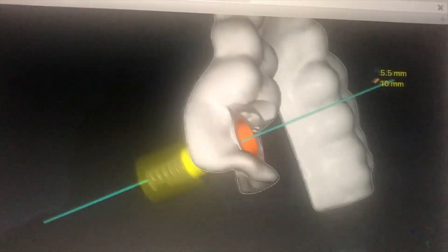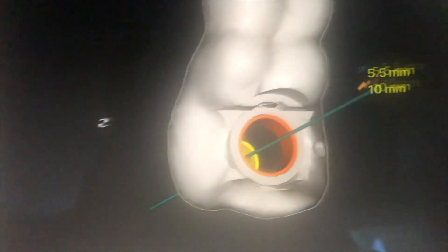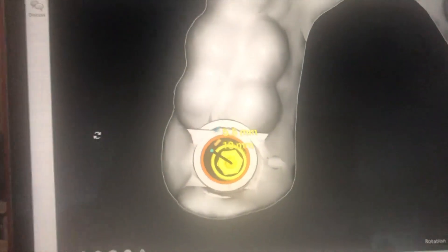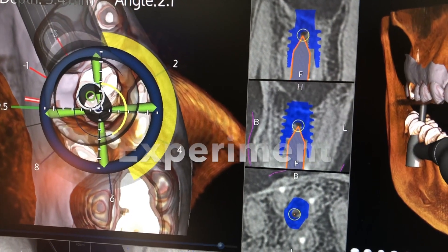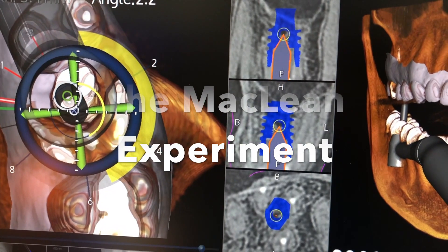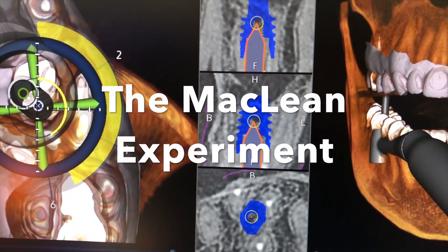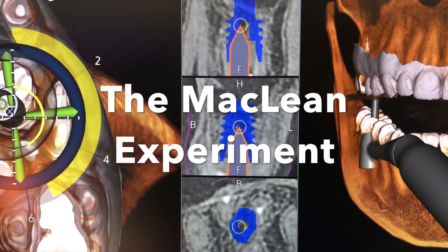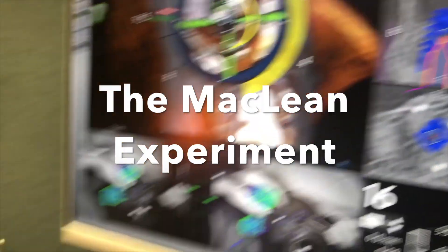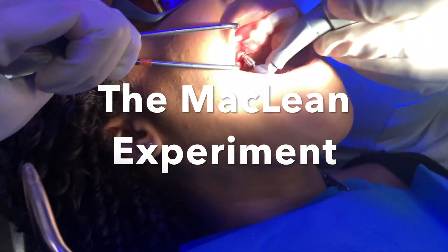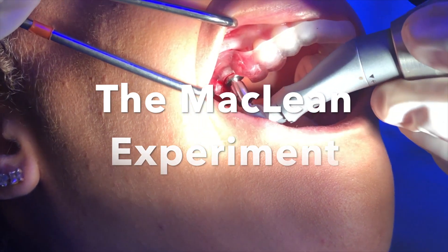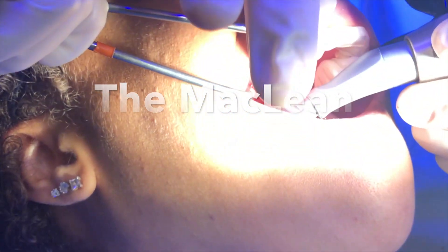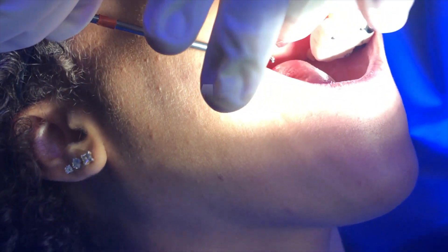It's very interesting to check one against the other, because the planning software should be sophisticated enough to handle this — we'll soon find out. After the template is fabricated, we can use the same plan to click and create an X-guide plan, which will be brought into the X-guide for dynamic navigational surgery. You can see the implant position and whether we're on target. The template is in position and the X-clip is also in position, so both are giving us feedback for guided surgery.